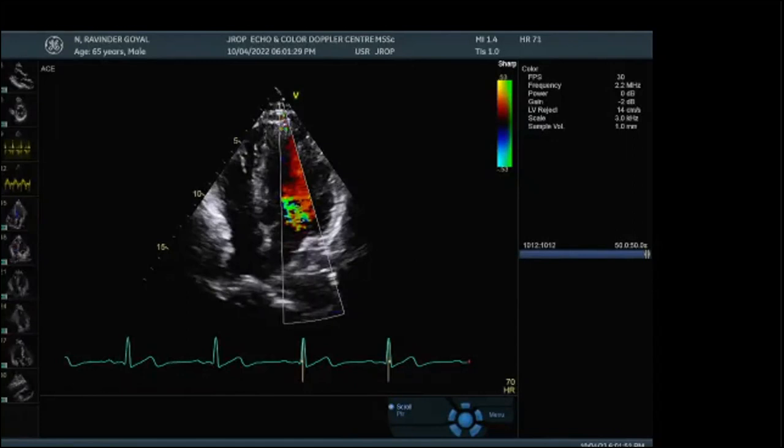On the other hand, peak velocity in the aortic and pulmonic valve will give you the severity of the lesion. That's why we use peak and mean velocity and gradient accordingly. So whenever a stenotic lesion comes, we have to measure their peak and mean velocity as well as their gradients. We'll come back to them when we are talking about valvular stenotic lesions. Is that okay? Okay, sir.